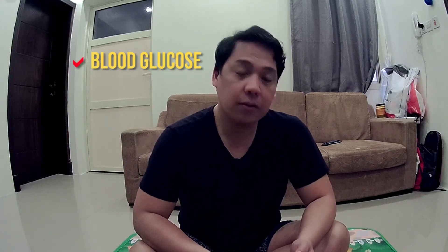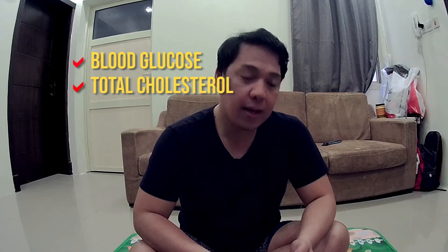Welcome to the first ever episode of unboxing and review. For the first episode of my unboxing and reviews, I'm going to be unboxing a device called the multi-monitoring meter — basically a three-in-one device that takes your blood glucose, total cholesterol, and uric acid.